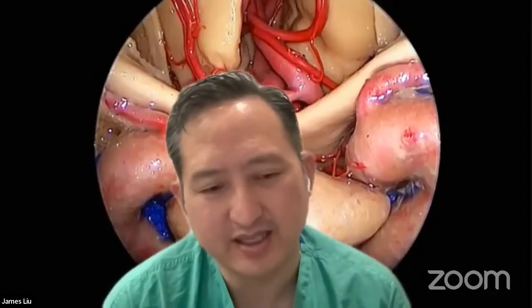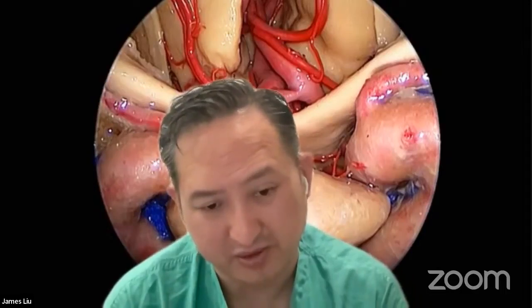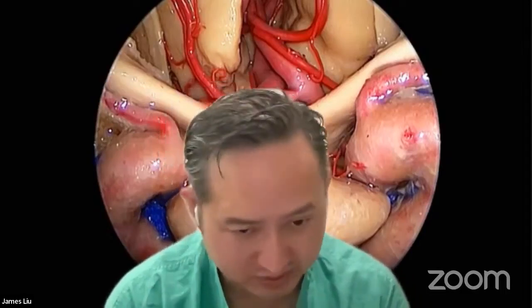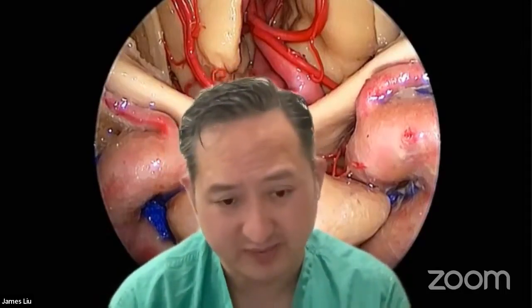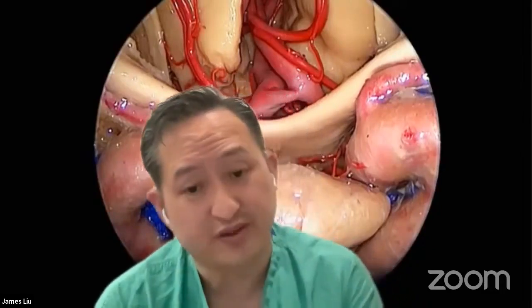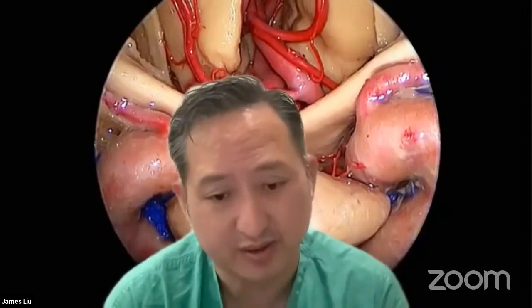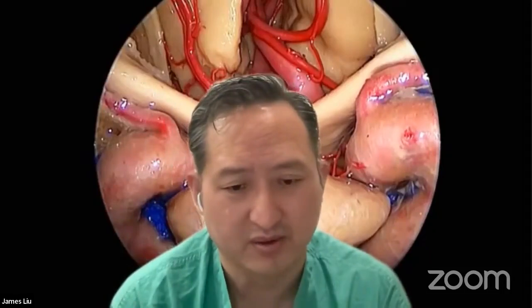I think if the tumor is extending more anterior above the planum, then you have to do a transplanum approach, drill off the planum, open the dura, and follow the tumor in the subarachnoid space. And for retrosellar, you have to make an opening in the dorsum sellae, so you can remove the dorsum sellae and posterior clinoids, and sometimes drill the back of the clivus to get more exposure.